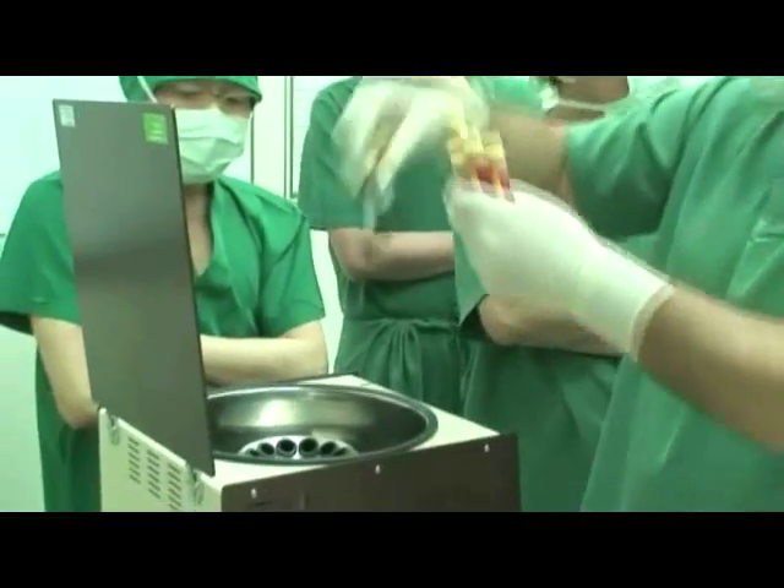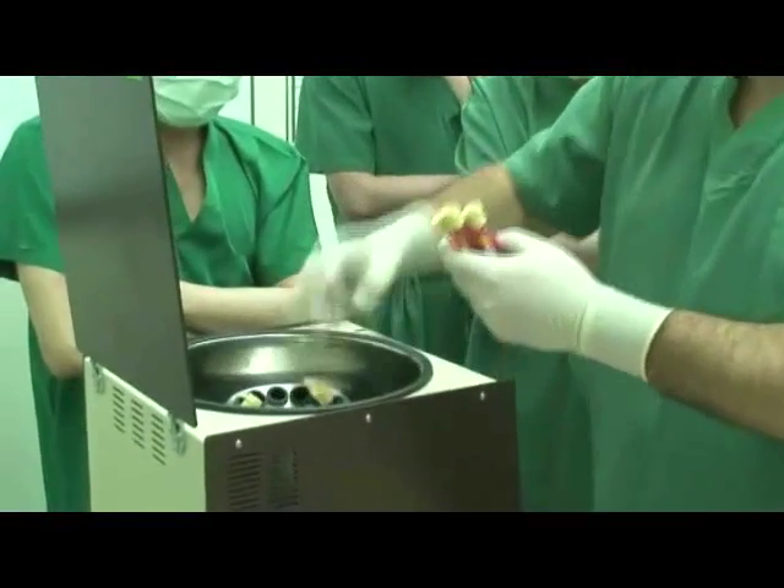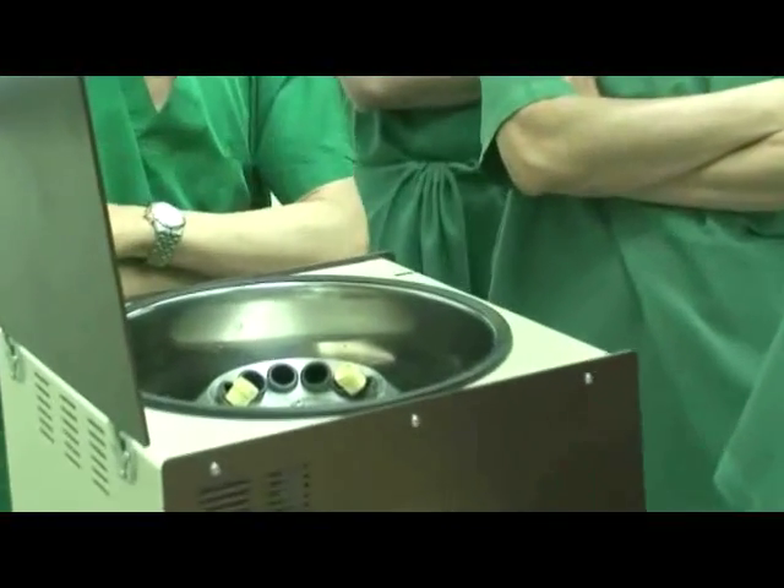Insert the 6 blood collection tubes into the centrifuge and spin at a low speed.